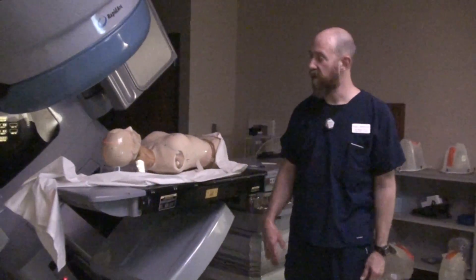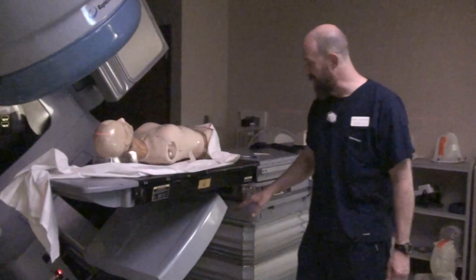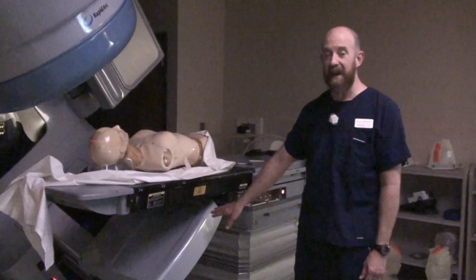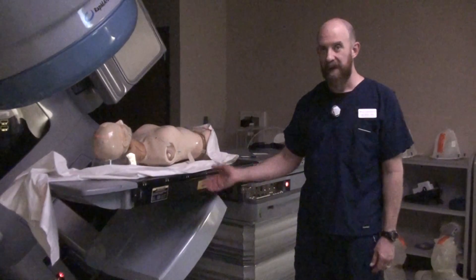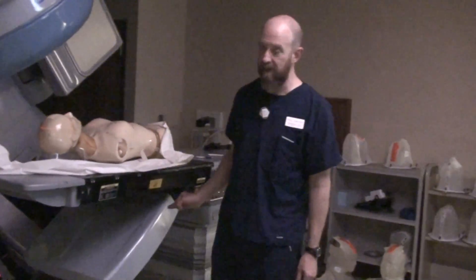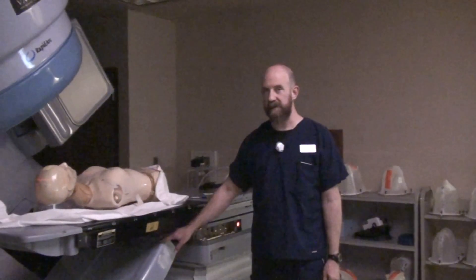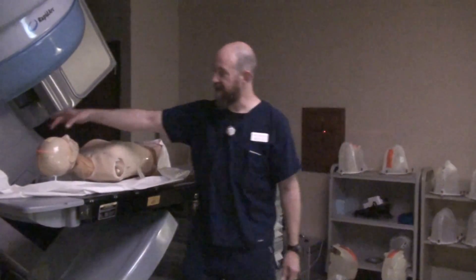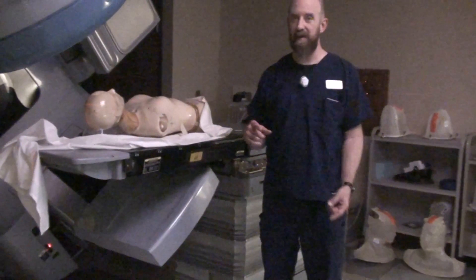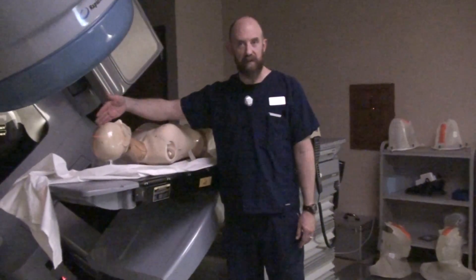If needed, move the image intensifier some more. Once the physician likes the fluoro, this is one time we're going to put a film in and not center the image intensifier — if we did that, we'd crash into the table. We're also not going to set the same TFD. Make sure you have notated what TFD you are away from the CR of the machine, away from isocenter. Check on fluoro that the field will actually fit on the x-ray. Either way, still put a film marker on it. Take the film and get it approved.